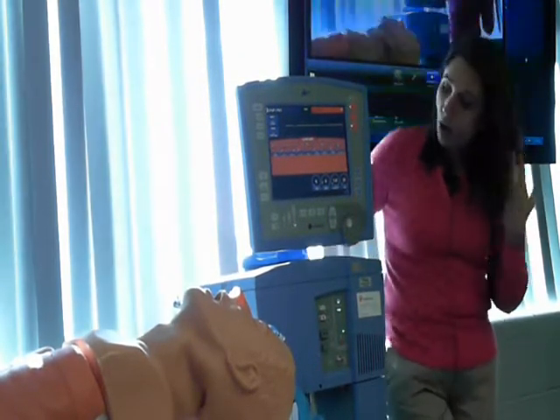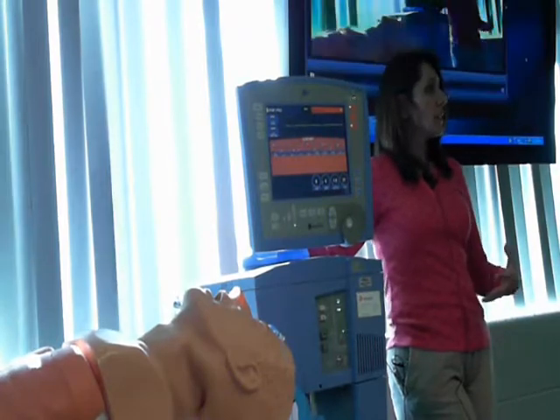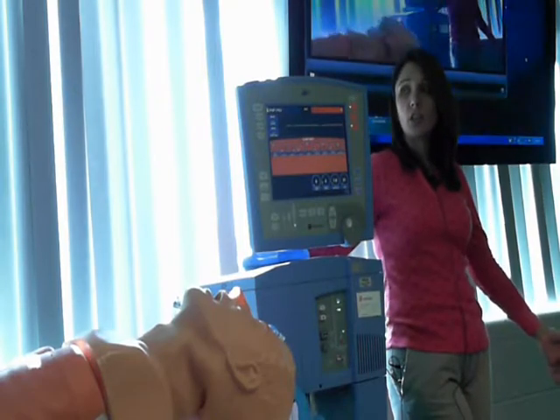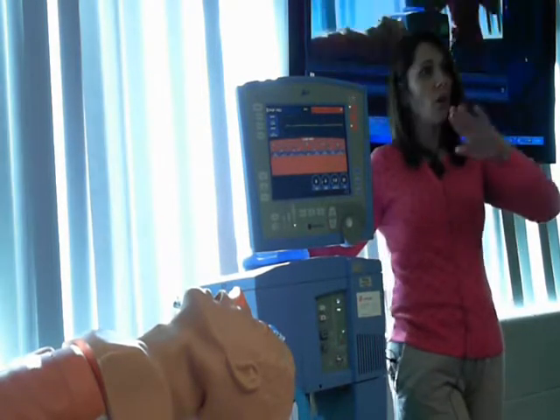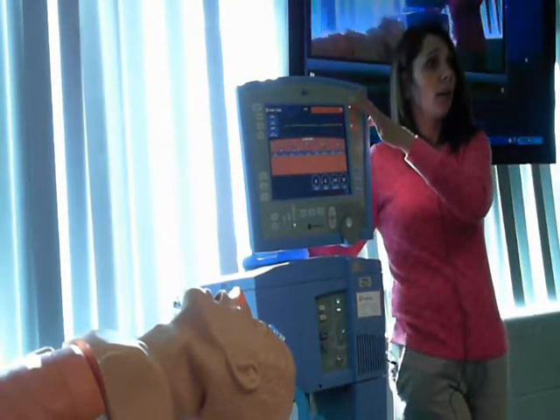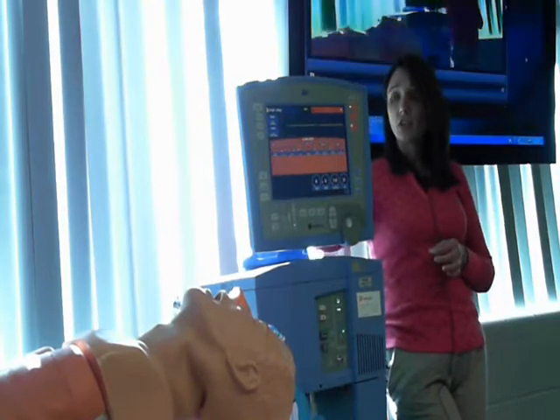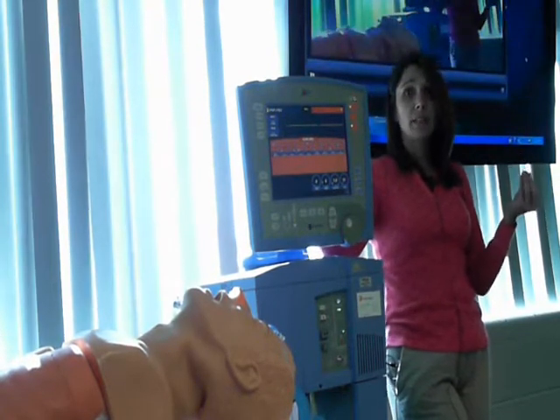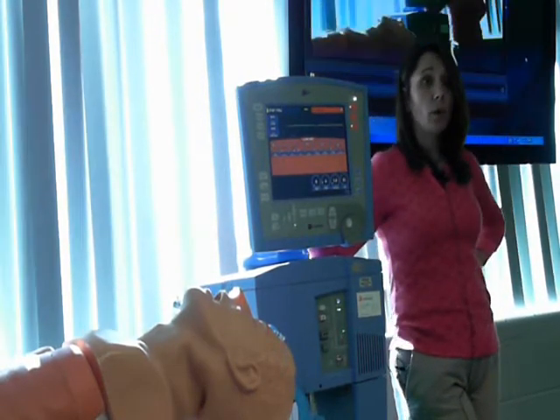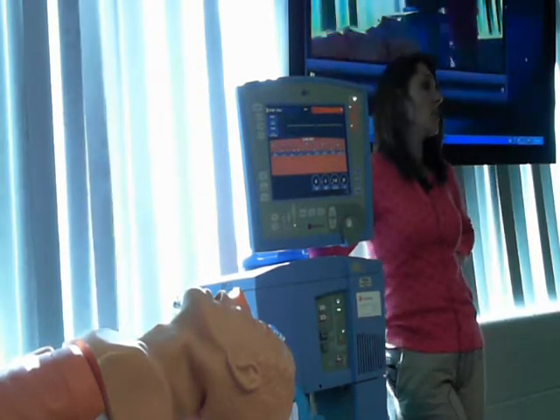Now let me tell you, all mechanical ventilators have this wonderful thing called backup apnea ventilation, and the therapist sets it. So that if the patient does not take a breath for 30 seconds, this machine is going to alarm. On all mechanical ventilators, there are going to be lights lighting up, and there will be audible alarms. Okay? So if that happens, the machine will alarm, and the therapist has set preset settings that if that patient doesn't breathe, we're going to pick up and breathe for them. But the machine is going to continue to alarm because it needs your attention or the therapist's attention.